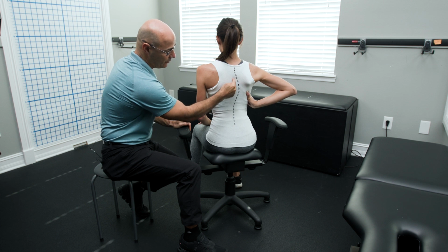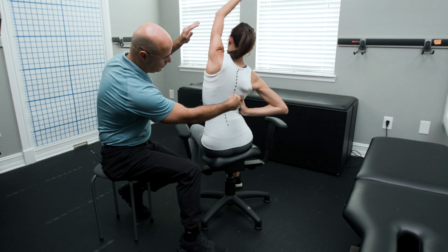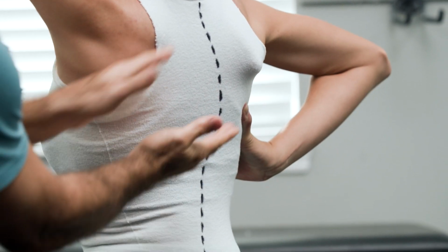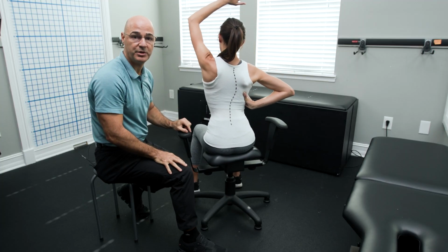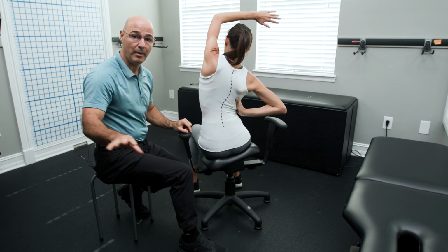And again, we want to increase the flexibility of this area, so her hand will go over her head, and she will perform the wobble exercise, trying to increase flexibility in this area. Again, with every wobble, she's opening up those discs and trying to unwedge them as she's wobbling through that motion. Okay. Good exercise to help warm them up for the upcoming intensive care.